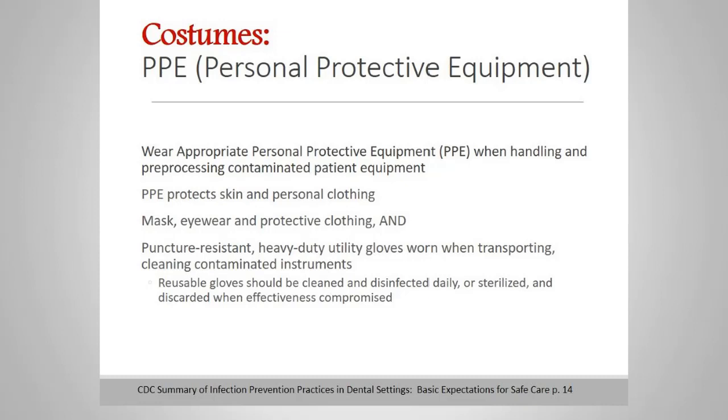And by that we mean the heavy-duty utility gloves that are a little bit more chemical resistant and puncture resistant than examination gloves. Anytime you are handling contaminated instruments, it is recommended that these are worn as they are much more protective. Now keep in mind they don't last forever, and if they become compromised, you see cracks, perforations, etc., throw them away, get a new pair. Some of these can be heat autoclaved. Look at your instructions for use and monitor that, and wear them whenever you are handling contaminated instruments.